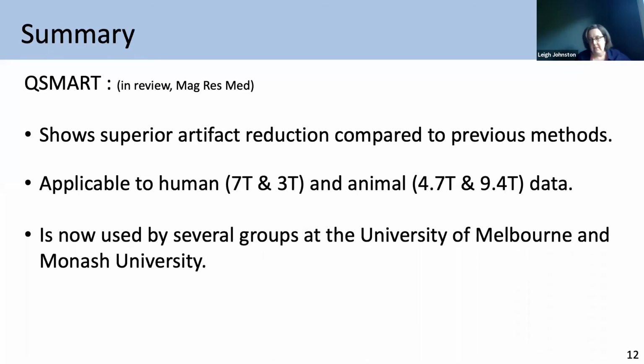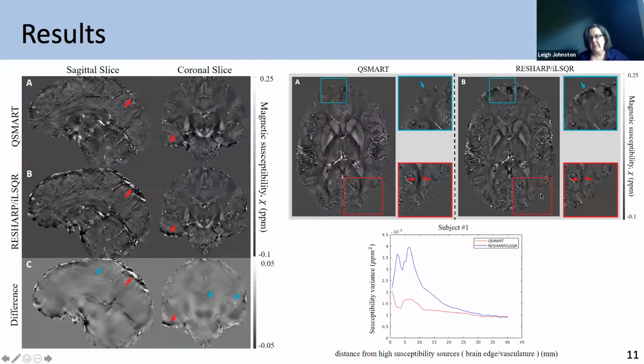I, however, will go back, and I'll just put up this slide again. I've deliberately tried to show you a bit of the nitty gritty of what it takes to go from the measured signal into these maps, right? There are so many tuning parameters in this, in terms of filter sizes, number of iterations that you do something for.